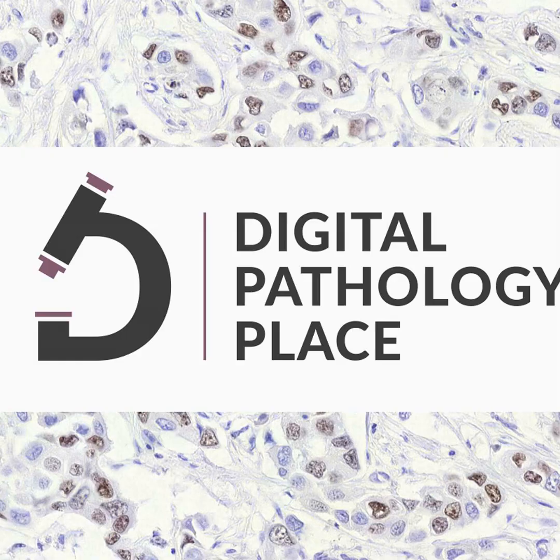So there's a few different things there. One is to understand what the common challenges are in the particular type of data you're dealing with. So if it's H&E whole slide images, there's certain common challenges like artifacts that I mentioned, like variations in staining from different labs, different scanners, changes over time. Those are just common things that you see with this type of imagery.